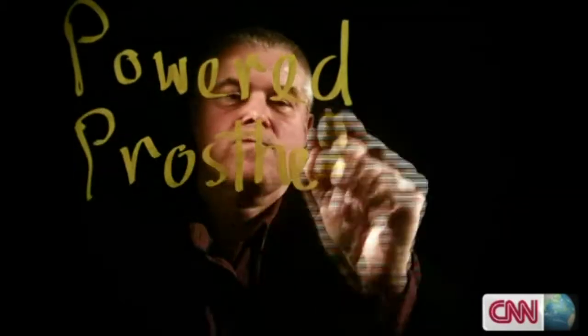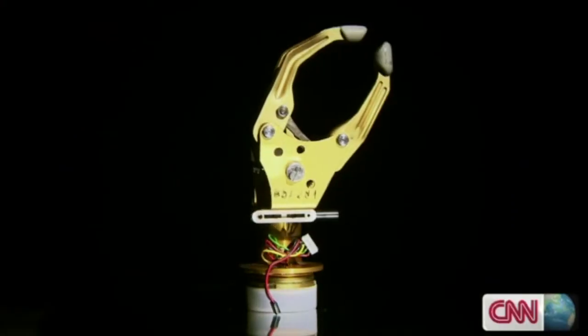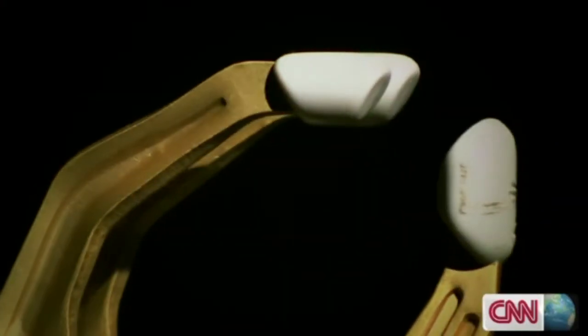This is the i-limb, a prosthetic hand built with individually powered prosthetic digits. The old generation of electric hands had what I would call a pincer grip, where these fingers are pre-flexed so they don't change shape, and the thumb is one shape, and they move like that in one plane.